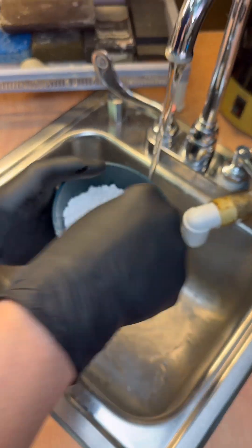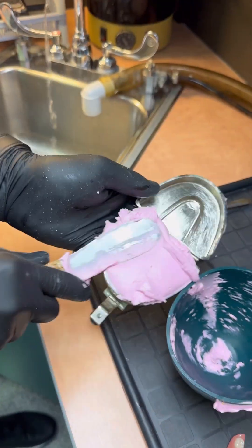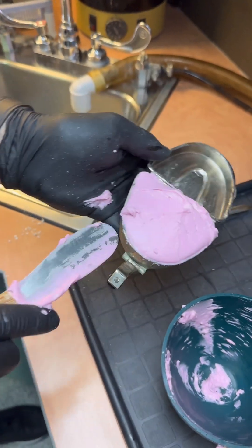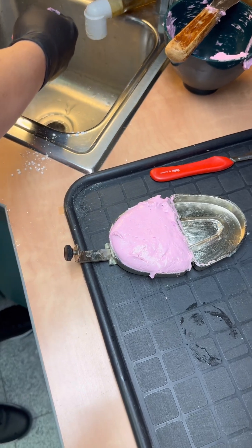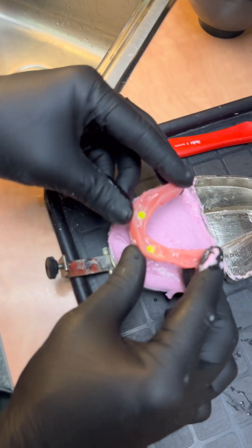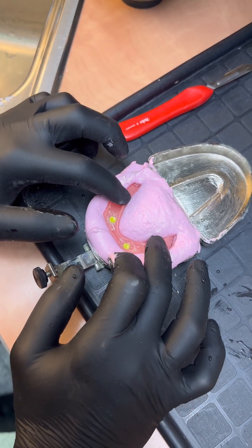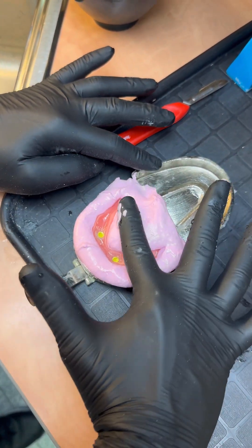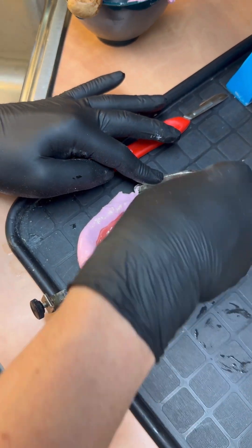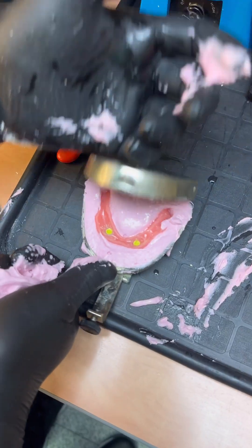Next, let's mix some alginate. Place the alginate inside the flask. Do not be afraid to overfill it and fill in the joint. Now let's take the denture, wet it and place it in the center and gently press down. With your finger, gently remove the excess. And close the flask.